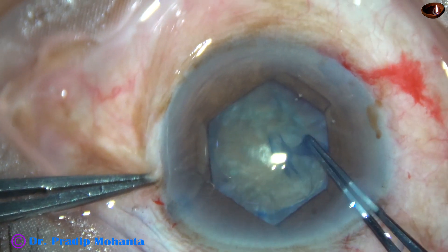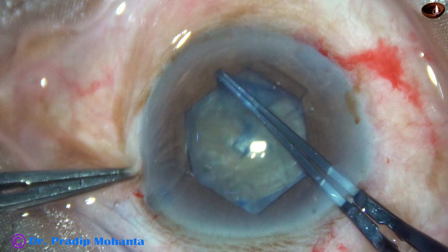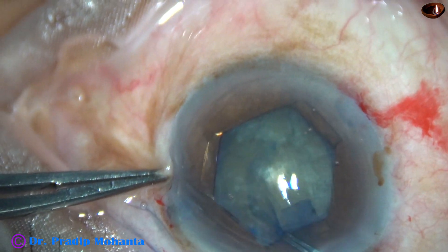Capsulorhexis is then completed. We get a capsulorhexis of about 5 mm.